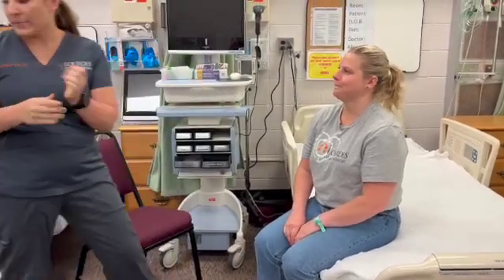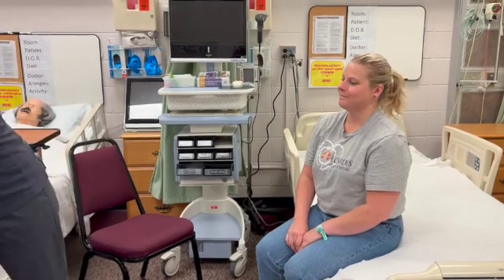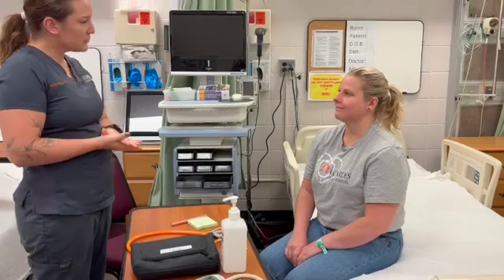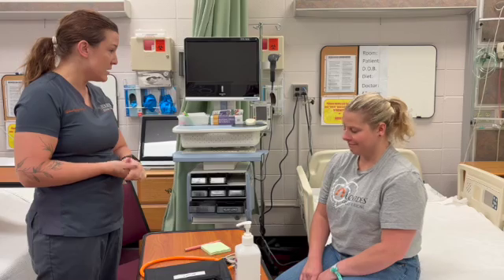So what I'm going to do — I brought in my equipment here — is I'm going to do a blood pressure on you. I'm going to check your heart rate, your temperature, your pulse ox, and your respiration rate. Is that okay? All right.